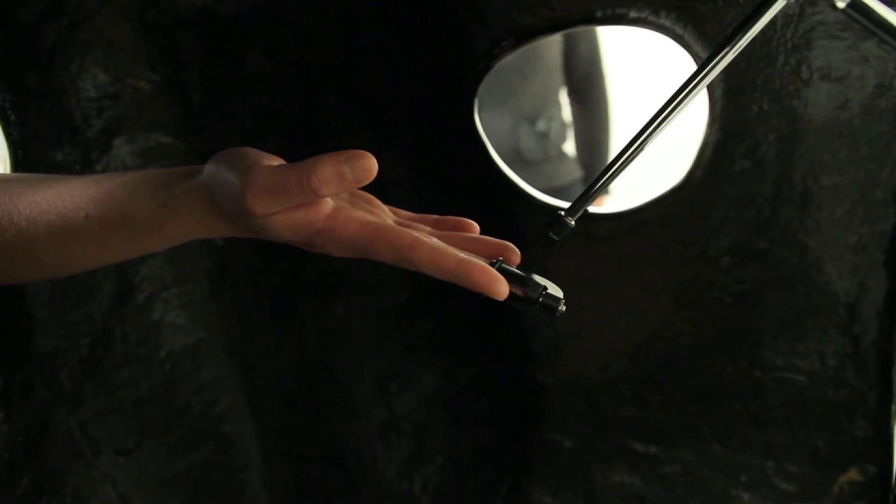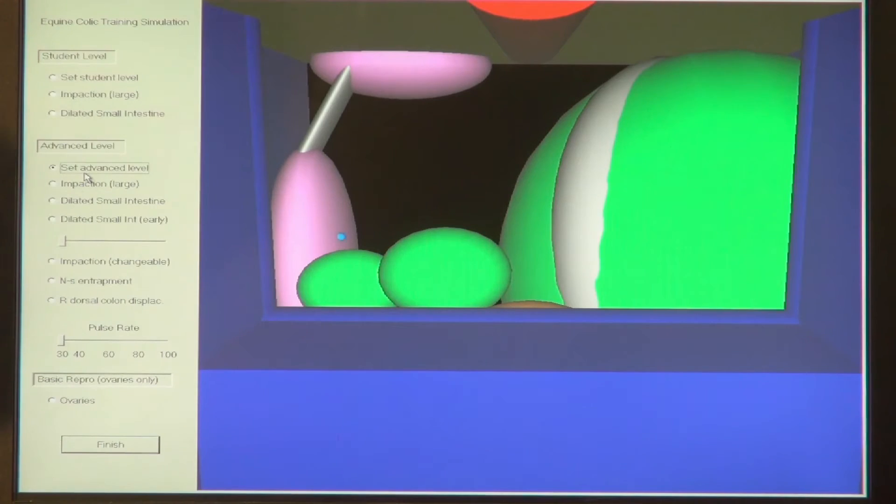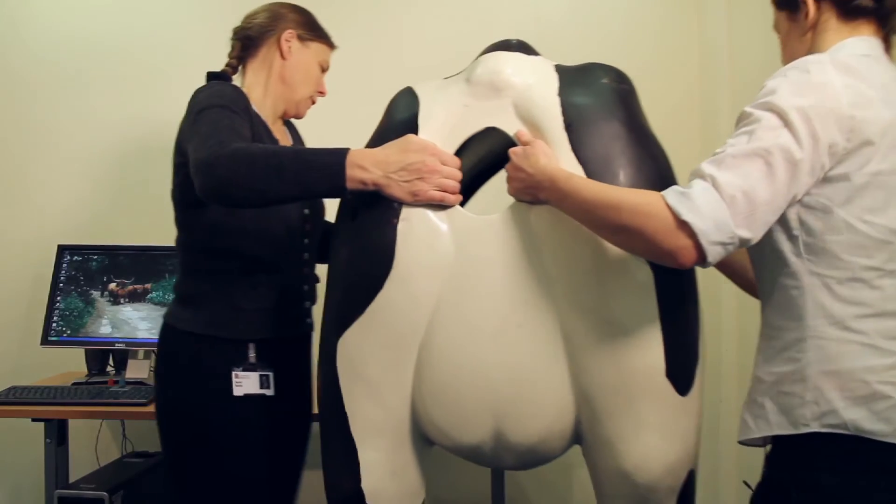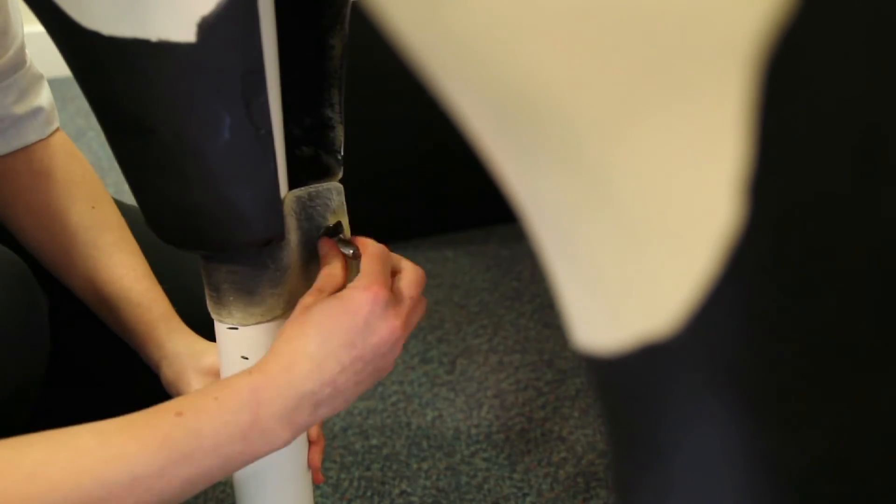Haptic force feedback technology allows interaction with a virtual bovine reproductive tract or virtual equine digestive tract positioned within a seemingly empty fibreglass model of the rear half of an animal. The same hardware is used for both systems.